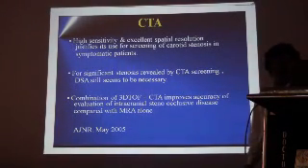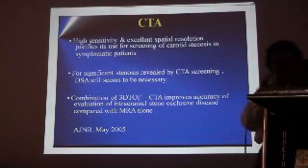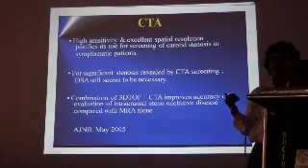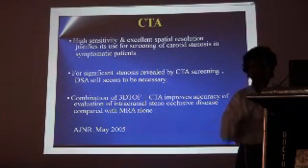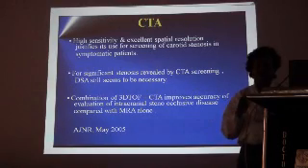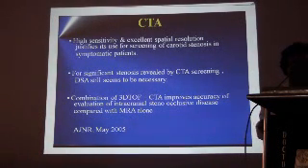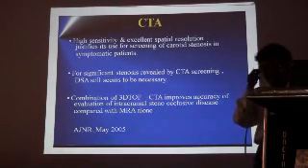is that diffusion helps early detection of ischemic changes in a particular part of the brain. And penumbra imaging is possible to show the penumbra, which is reversible. It can be reversed back to normal and maximum damage can be prevented. So that is the importance of diffusion, provided you have adequate infrastructure to treat the patient, because not all patients are fit for thrombolytic care.